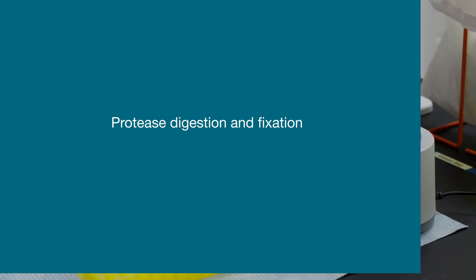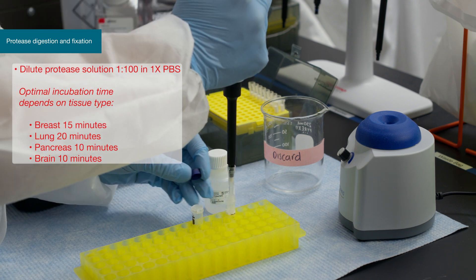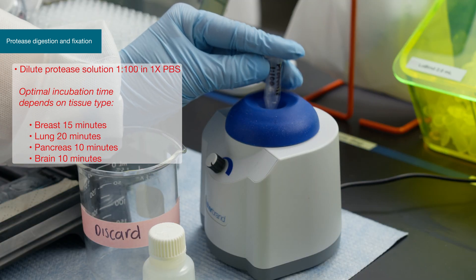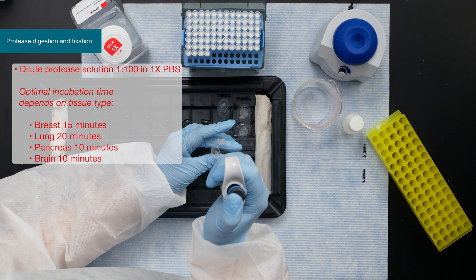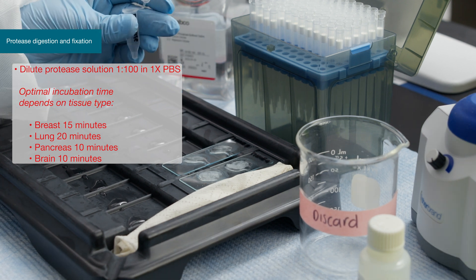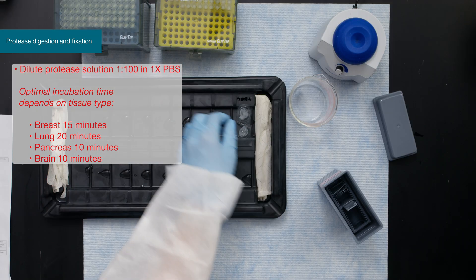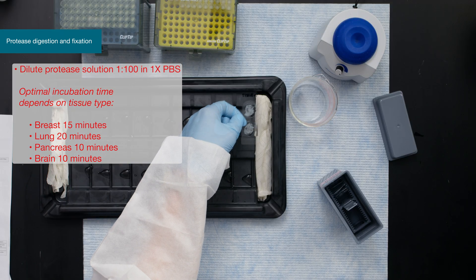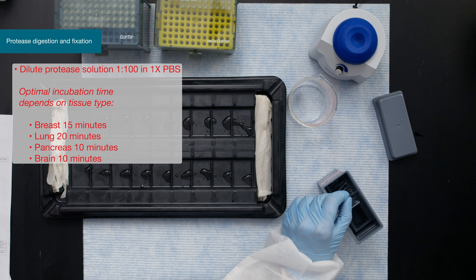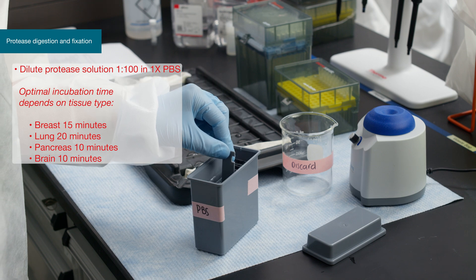Once the samples and reagents are prepared, perform the protease digestion and fixation. Prepare the working protease solution by diluting in pre-warmed 1X PBS. With the slides laying flat in the slide chamber, add the working protease solution to the tissue, making sure the entire section is covered. Close the slide chamber and incubate for the optimal time. Remove the protease solution, wash gently two times with fresh 1X PBS, then fix for five minutes and wash again.